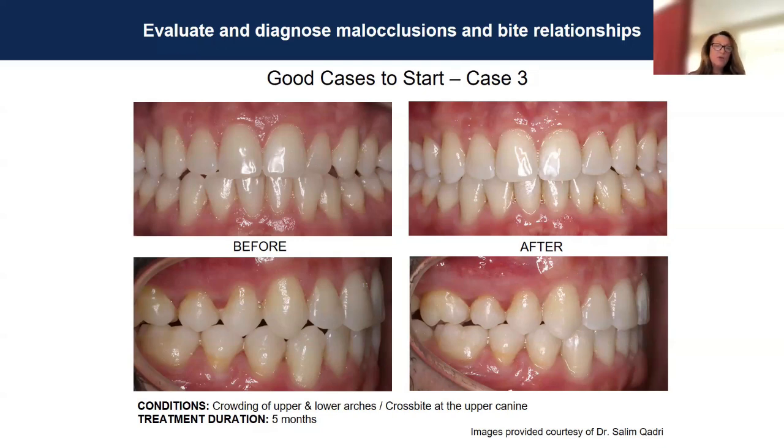And sometimes if you have a case where the patient was happy with the results, but you wanted to go a little bit further, you can always do a mid-course correction or refinement to change anything. And we'll get into that, so stay tuned for another webinar where we will go over mid-course correction, attachment removals, and tracking issues.